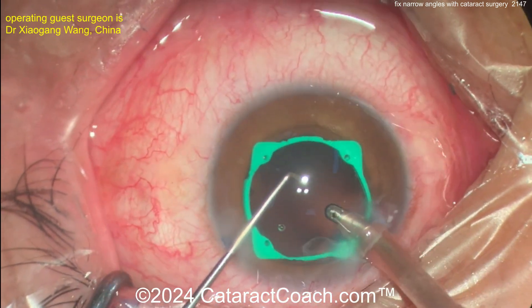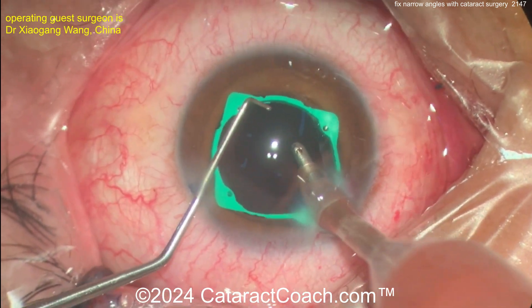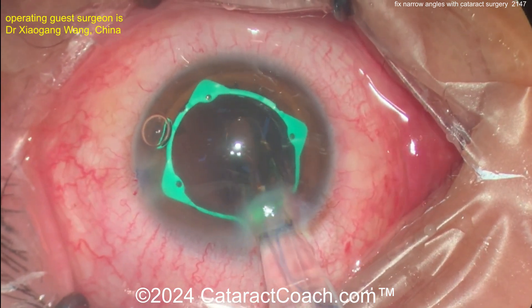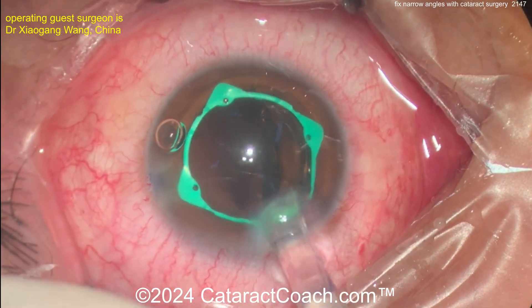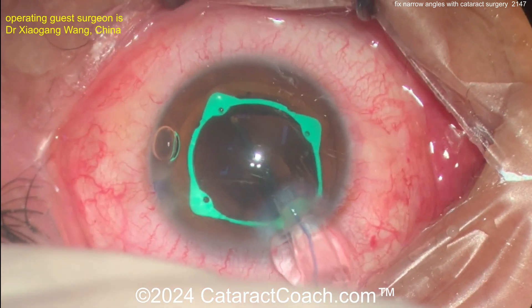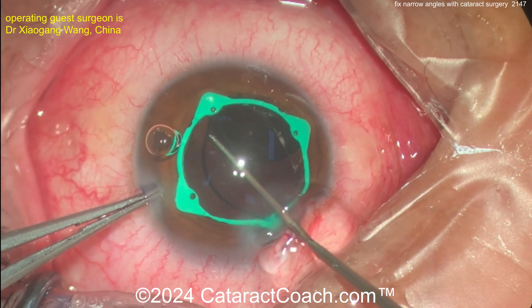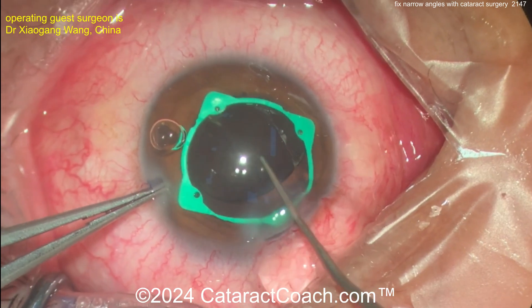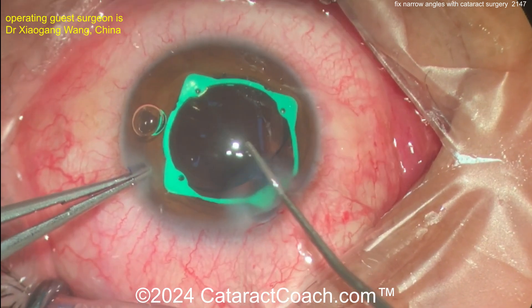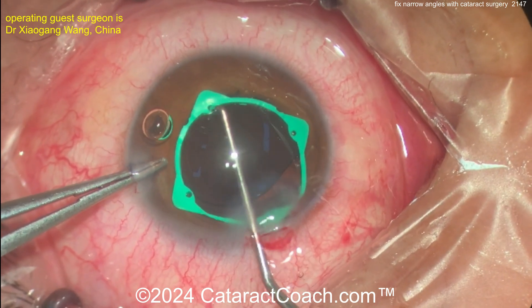This is a neat procedure that will really help your patients. If your patient has very narrow angles and is of cataract age — maybe 60-plus years old with some degree of cataract — your first-line treatment should probably be cataract surgery, pseudophakia. Studies have borne that out: the best treatment for a 60-plus-year-old with very narrow angles is likely just doing cataract surgery.